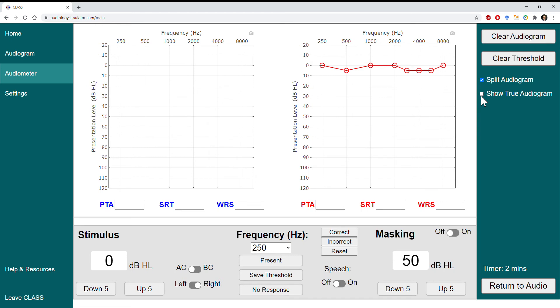To switch ears, you can use the toggle, or push the E button to switch over to the left-hand side. You can also push L for the left ear or R for the right ear. We'll return to 1000 Hz, and since we know this is a symmetrical hearing loss, I don't need to start all the way up at 50 dB HL, but you're welcome to do so if you prefer.